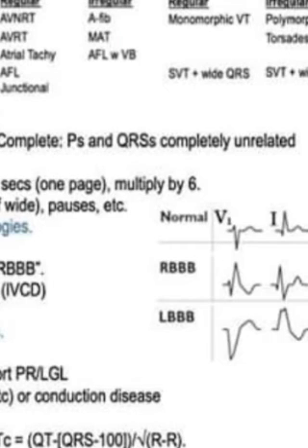Non-sinus tachycardia, narrow QRS: SVT, regular: AVNRT, AVRT, atrial tachycardia, atrial flutter or junctional tachycardia. Narrow QRS SVT, irregular: AFib, multifocal atrial tachycardia, atrial flutter with variable block. Wide QRS, regular: monomorphic VT; SVT with wide QRS complex can occur. Irregular: polymorphic VT and torsades.